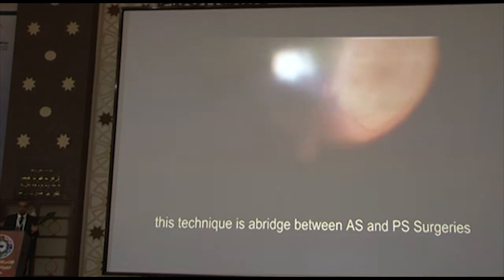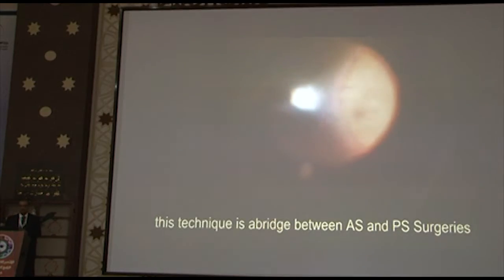And I consider this a bridge between anterior and posterior segment surgeries. So you are doing cataract surgery, and if you see something, you can do more procedures if needed. All right.